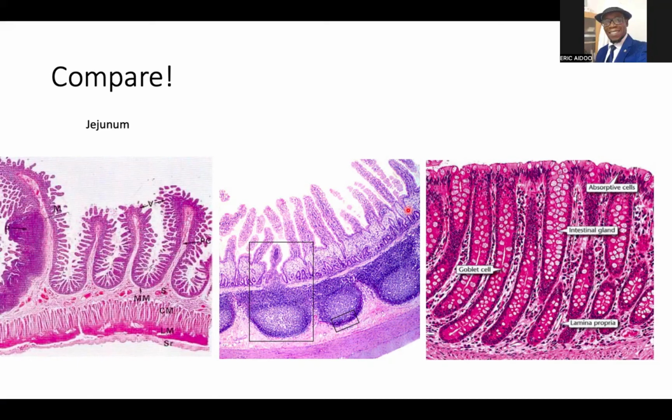So that is jejunum. Be sincere to yourself about whether you got it right. If you did, then kudos. And that is the ileum, and that is colon. Remember the jejunum and its prominent villi and the characteristic nature of it. They are more like perpendicular villi.